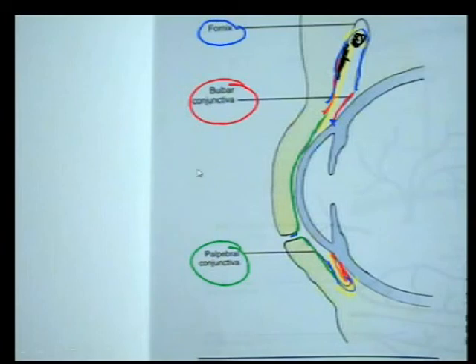Now, that being said, it's not uncommon for lost lenses to get stuck up here. And there have been multiple cases where people had multiple lenses up in this upper conjunctival sac. You've got very few nerve endings up there, and so unless the patient takes the time to push their lid up, or the eye care professional pushes the lid up and takes a look, the lost lens may actually just be hiding up here. And that's why it's important anytime a contact lens patient comes in for a follow-up visit and they say, well, I lost my lenses, you take the time to take a look to make sure that the lens isn't stuck up there.